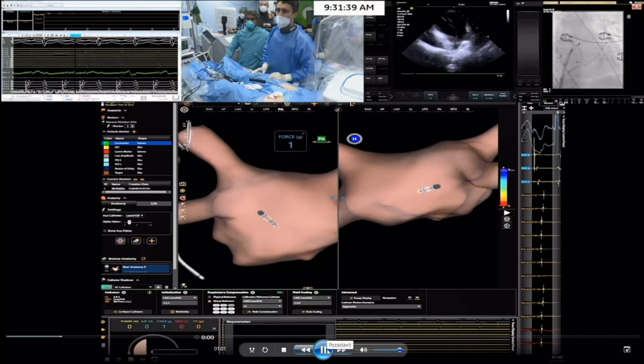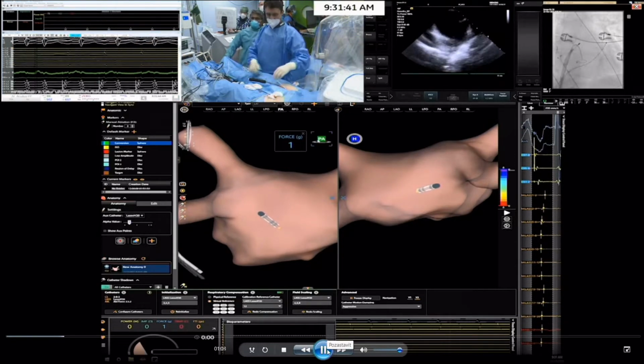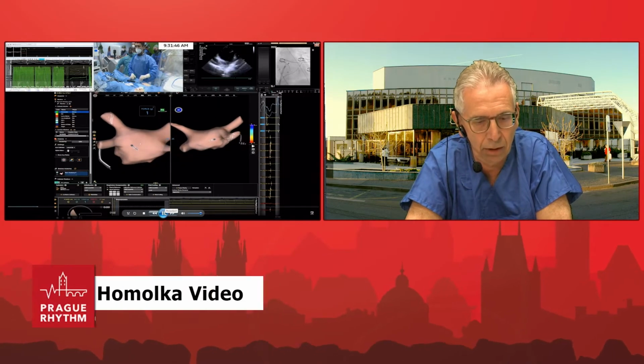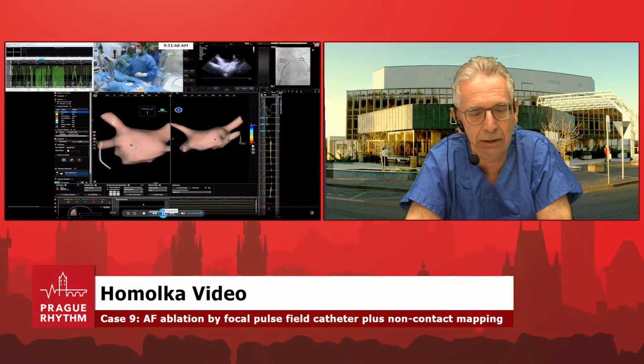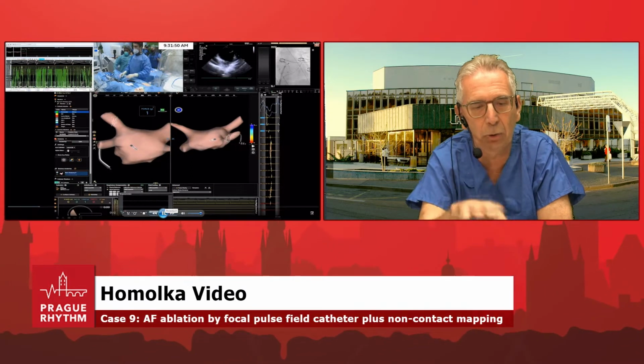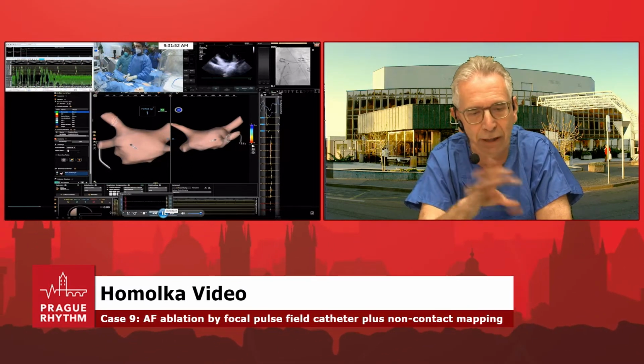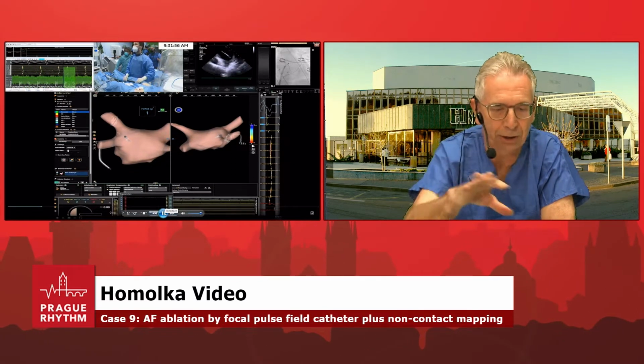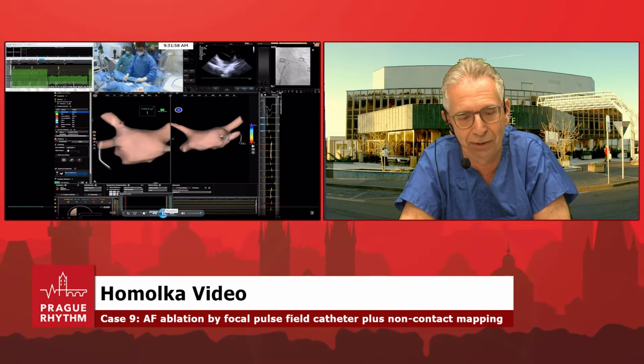Perfect. Okay, so he's ready to start. As I told you, we have a contact force catheter. Patient is in what rhythm? Perfect. And he's preparing his lesion, but you need to understand it was one of the very first cases, so he was very cautious to place the first lesion.